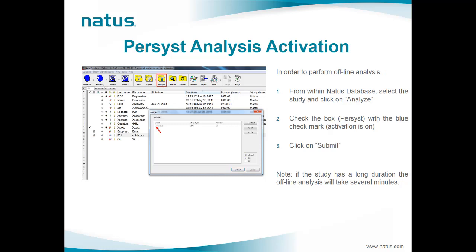Please note that if the study has a long duration, the offline analysis will take several minutes, especially for LTM and ICU recordings. In this case, it is recommended to run the analysis online during the recording so that once the recording is completed you will immediately get the results when you open the study in review mode.